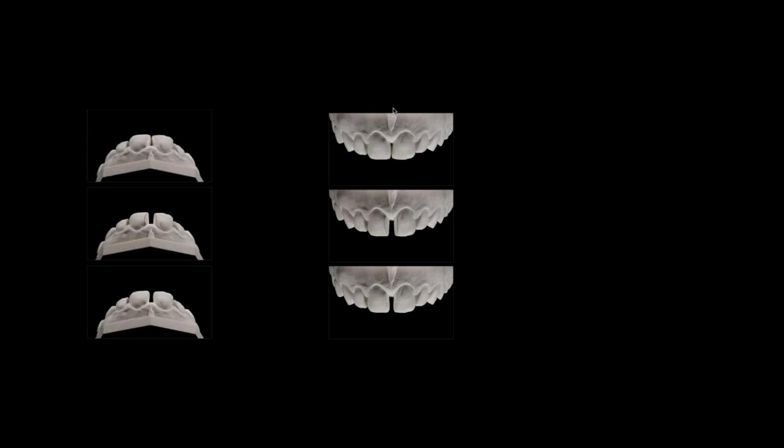Okay, so here you can see in this case I use not gray wax, I use the white wax from the set of the aesthetic wax set. I use the white wax just to not have this contrast between white stone and the wax-up. I want to present that to the patient, and you can easily see the difference between the pre-op phase and the final phase.